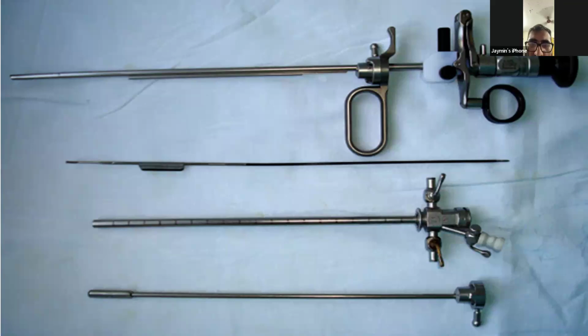And it is of the standard size of 21 French, with a channel attached on the top, and an inflow channel, to which the working element of the VIU gets attached. And what else does it have? On the side, the top channel for wire insertion, sir. And to complete this sheath, it can also be used with a half moon sheath along with this.